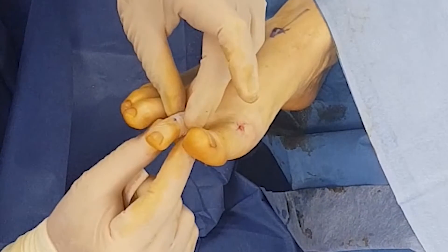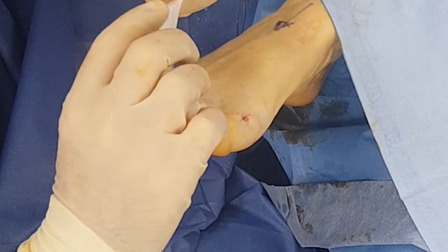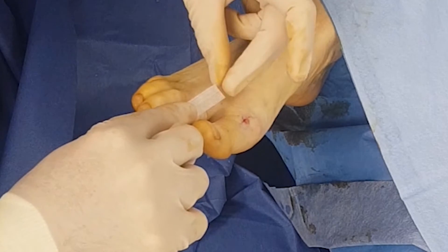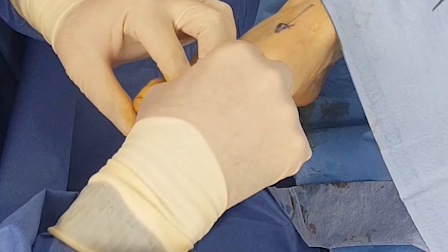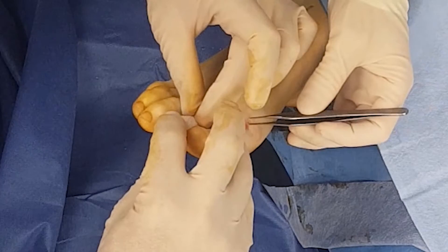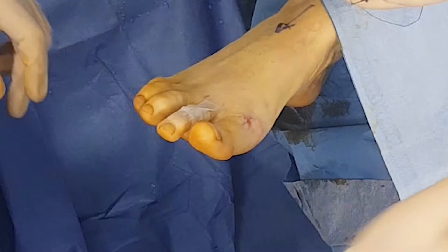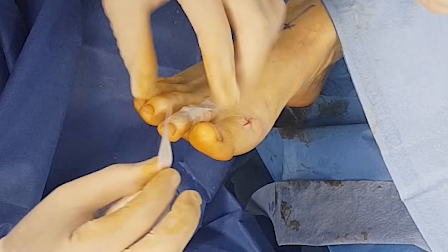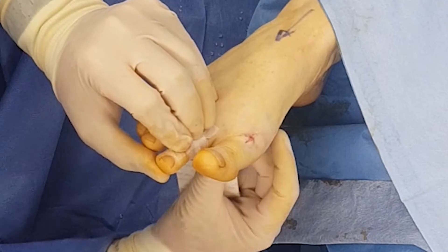The last thing to do now is to apply the steri-strips, which will support the skin closure, and to tape the toe down. It's very important to tape the toe down because soft tissue always wants to go back to its abnormal position. So where I had done the percutaneous extensor tenotomy, that tendon will heal back up again, but we want it to heal back elongated and not retracted like it was. So we're going to use some short steri-strips and some long steri-strips to take that toe down, then apply a Jones compressive dressing on top, and the patient will be reviewed in one week.